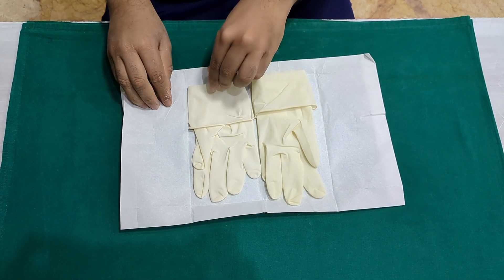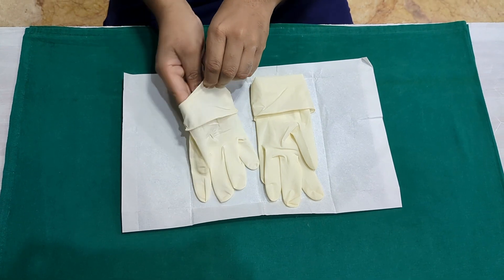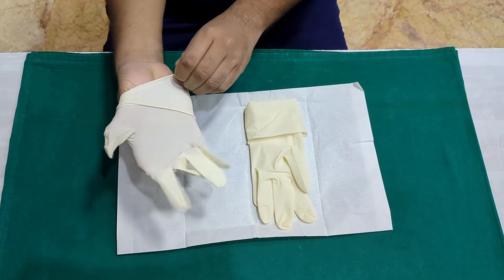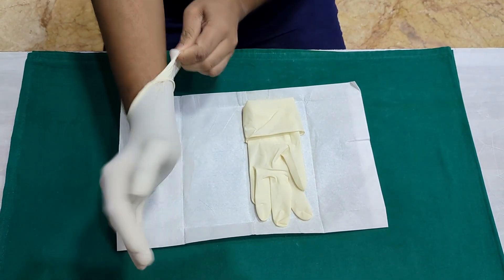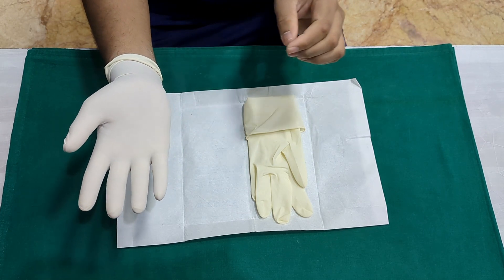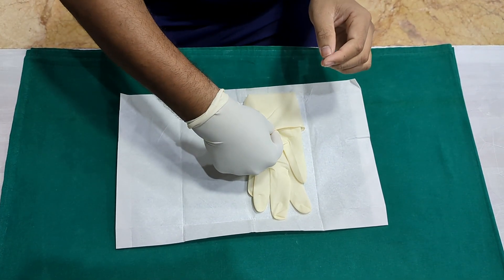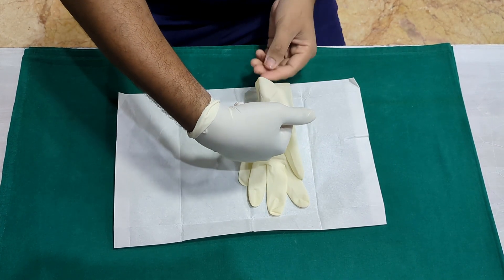Use your non-dominant hand to hold the outer surface of the dominant glove and slide your dominant hand inside. Once you get the sterile glove on your dominant hand, slide two fingers underneath the cuff that's folded over so that you have sterile glove touching sterile glove. Lift the glove using two fingers and slide your non-dominant hand inside it.